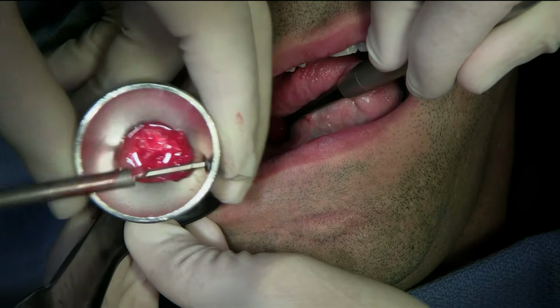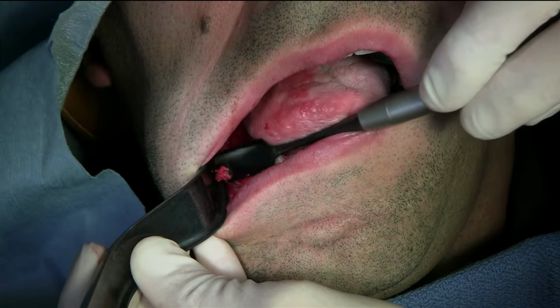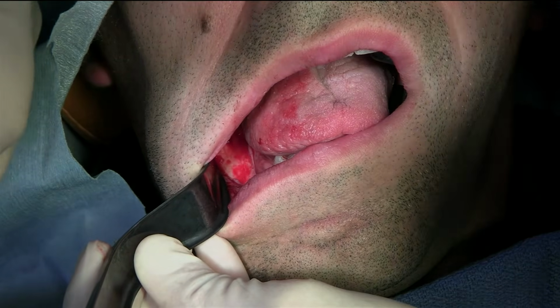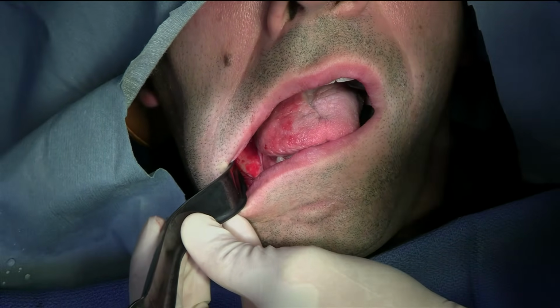It's already in there. Put more. Put this one in here. I'll show you now the second scraper so you can see the difference a little bit. Here's some bone as well. And I put in the second scraper a little bit of saline.